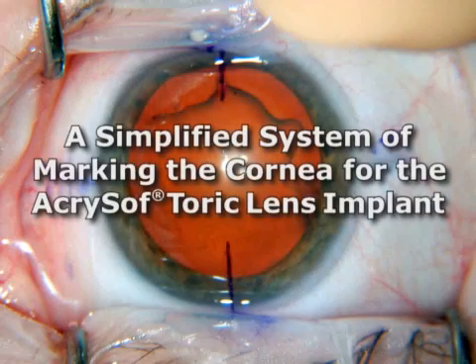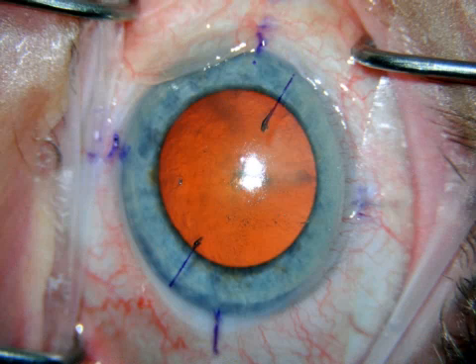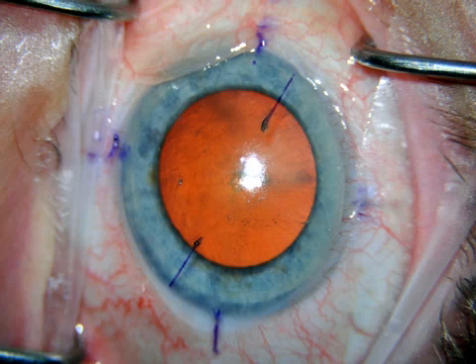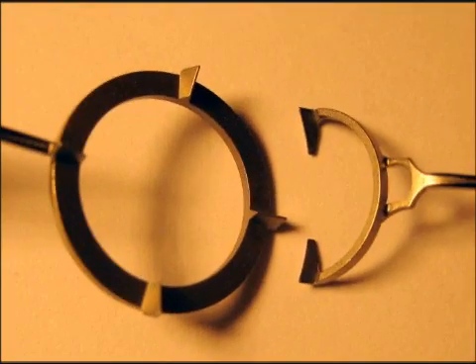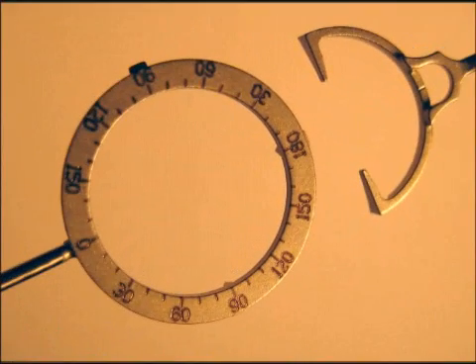I am Dr. John Grayther. This video will present a simple three-step marking system that generates precise corneal ink marks for toric lens placement. The two instruments set includes a degree gauge with bars on the back surface aligned on the horizontal and vertical axes, and a half-circle marker that fits precisely inside the ring of the degree gauge.